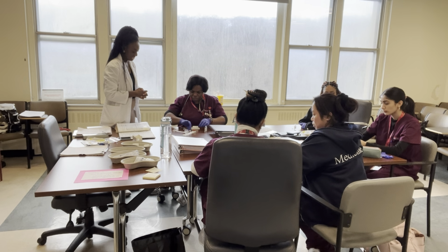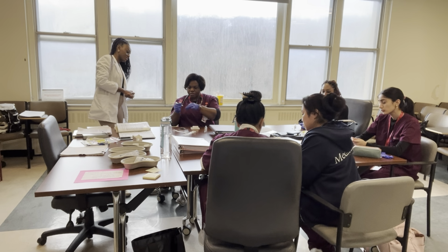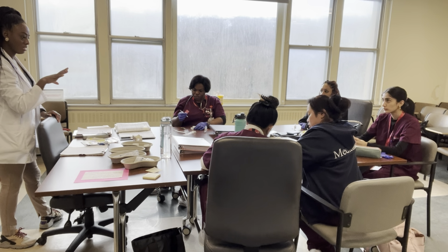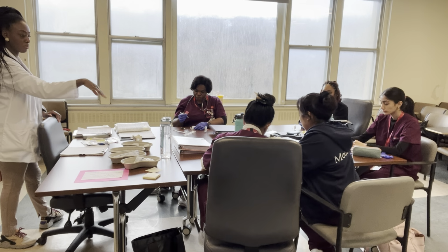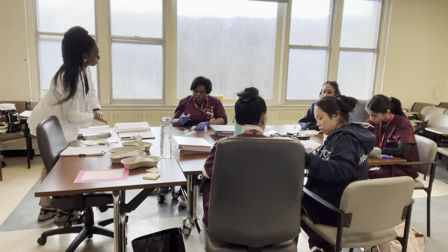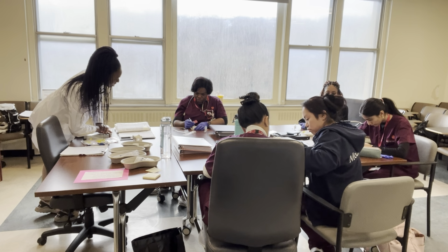Look at the needle. Yes, good. So one is watching you. If anybody has any questions, you can ask me, or how you both are practicing, that's awesome. And the collaboration, keep going. I go 45 degrees. Good, I'm seeing your needle straight, good.